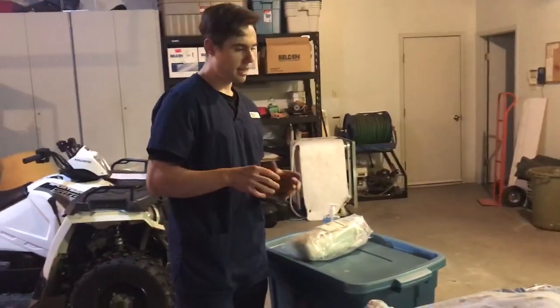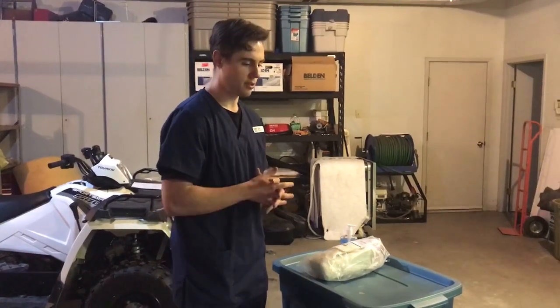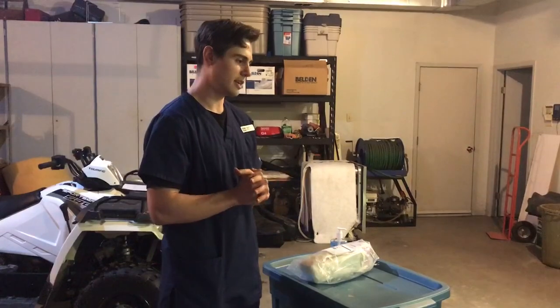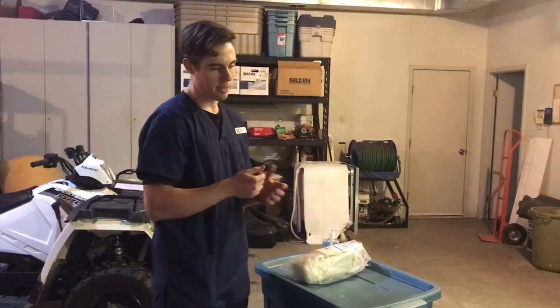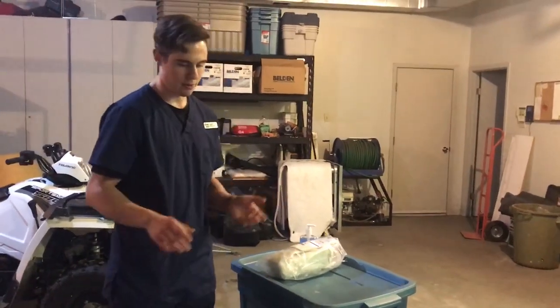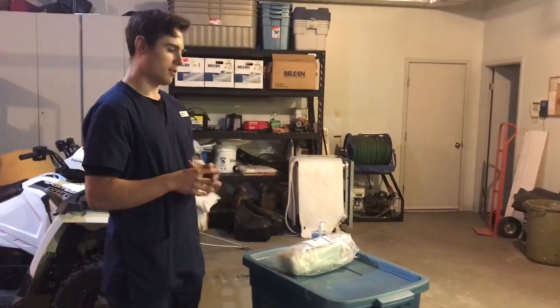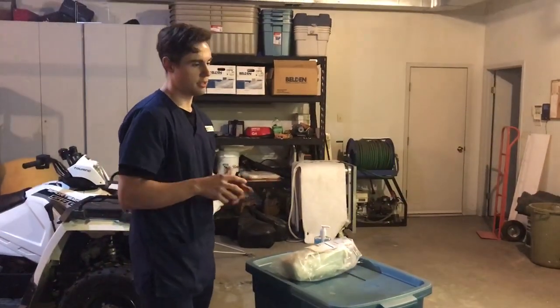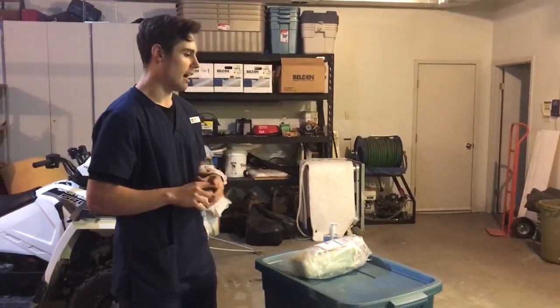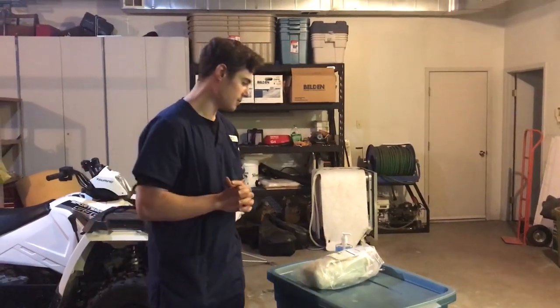So today we're going to be inserting an indwelling Foley catheter as per doctor's orders using sterile technique. We're going to insert a tube which goes in your urethra, and the tip will be in the bladder, held in place with a balloon, and that will constantly drain urine into a drainage bag, so we can record the output closely, record your ins and outs. He is okay with that and will cooperate with the procedure, so we can move along. After that, I will pull the curtain to maintain privacy.